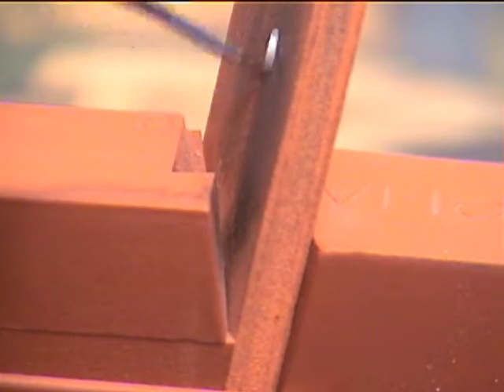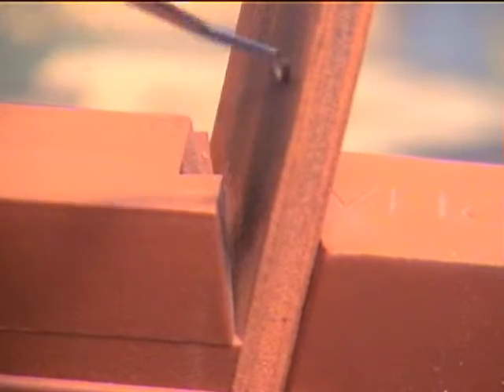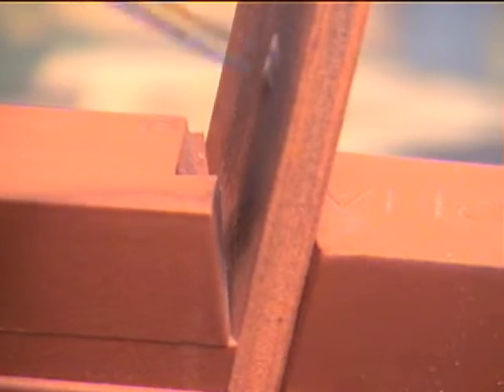Stroking the side of the instrument against the Hone for about 5 seconds, then move to the other side of the V-Hone for the opposite edge. Position the tip of the Columbia curette in the groove with its face at an approximate 45 degree angle to the Hone.